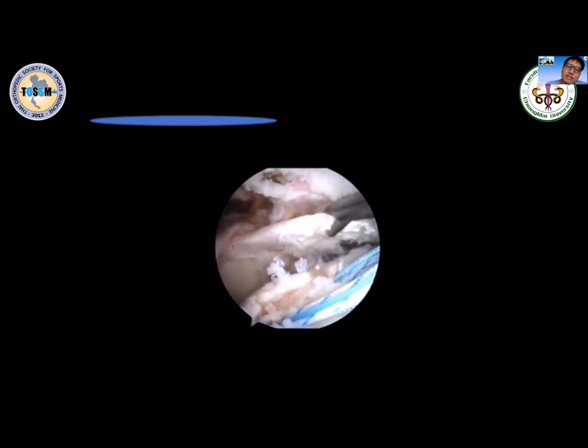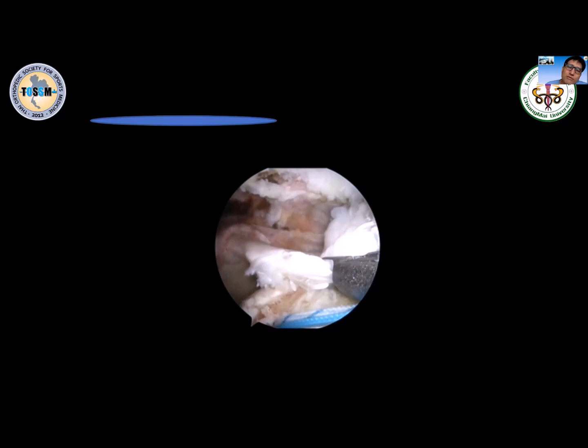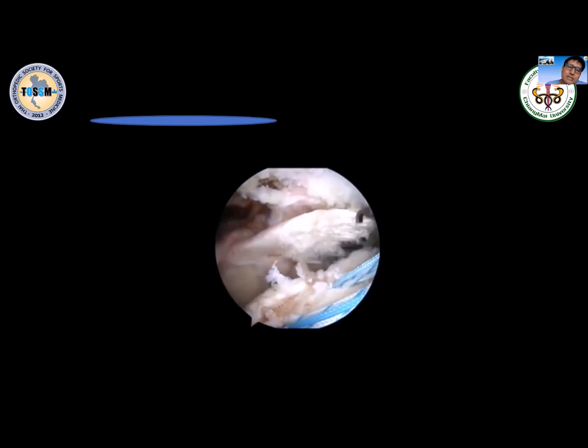So what I did, I would like to repair my infraspinatus right there. This is a cut bicep. I would like to move it right there.